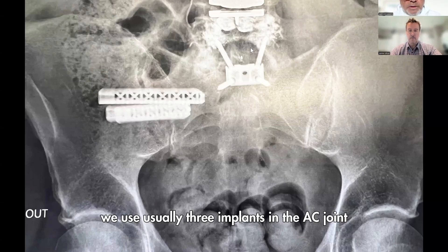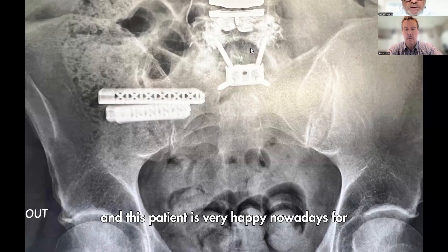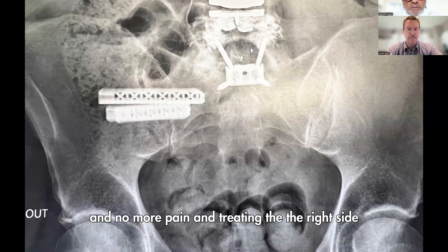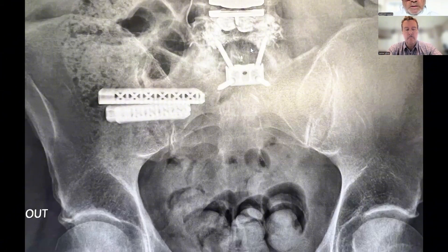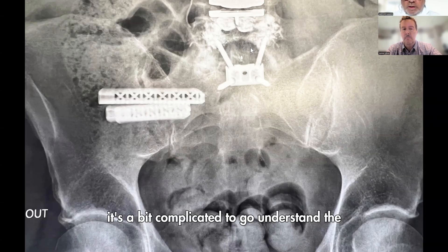You can see here the implant — we usually use three implants in the SI joint to stabilize the joint perfectly. This patient is very happy now at one-year follow-up with no more pain. Treating the right side also alleviated the pain on the left side — sometimes it's complicated to understand pain behavior in the pelvis.